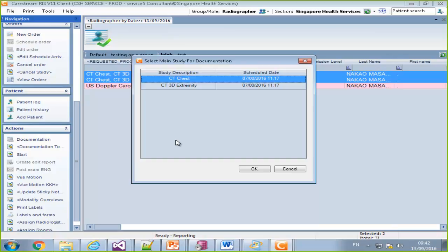But for them, we'll see again that we'll have to decide for each group which is the main study. And the whole concept of a main study is just the data window infrastructure. It holds one study. We can't really have them all in there together. To the user, it's essentially invisible. The data window should be identical. The document together group should really be designed around how they're documented, what data windows are like.